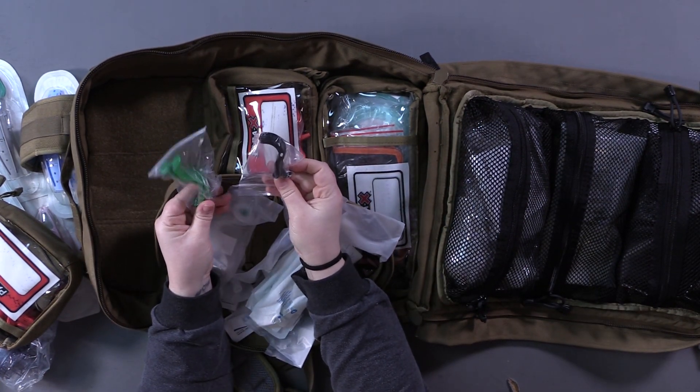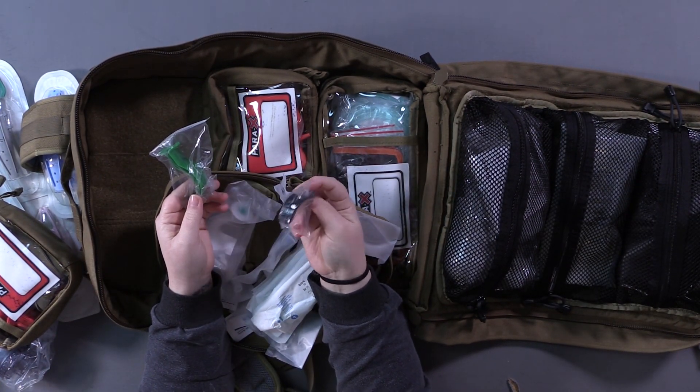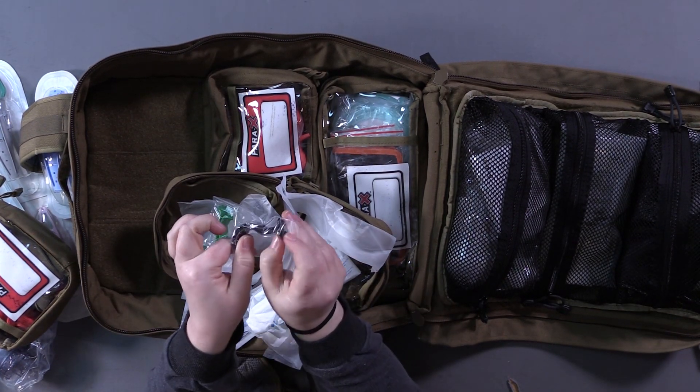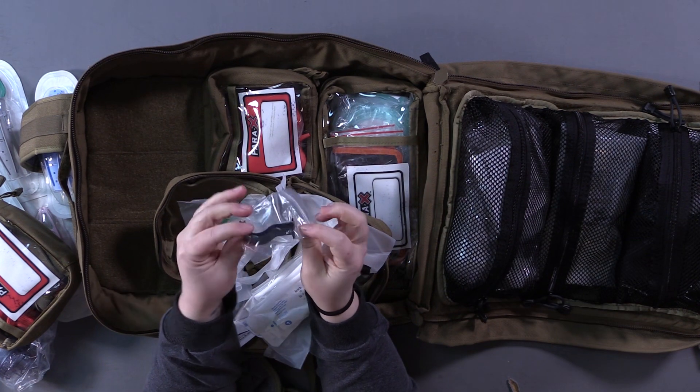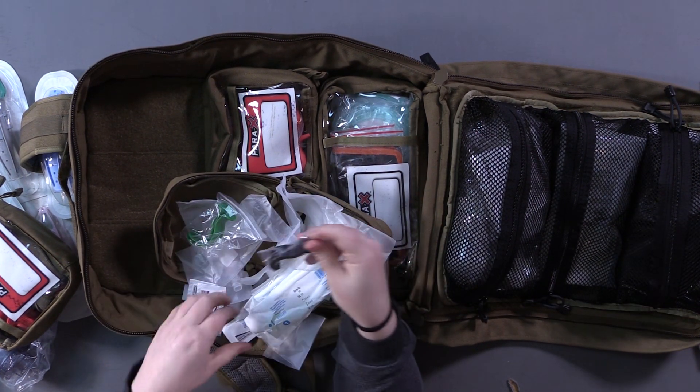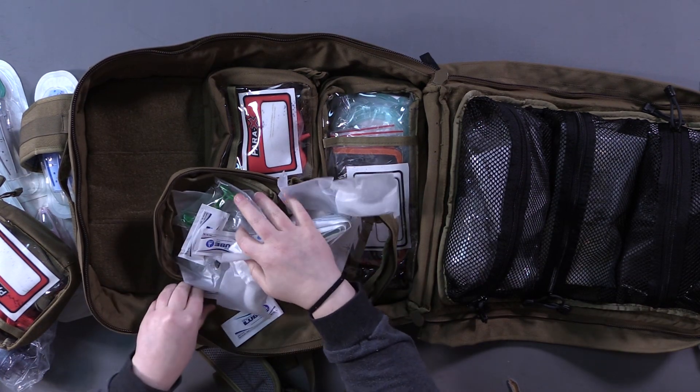These go in and hook on your teeth — from the top view your tongue goes right there, so it goes in behind your tongue and helps keep that forward to protect your airway.